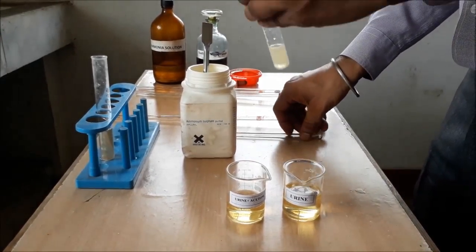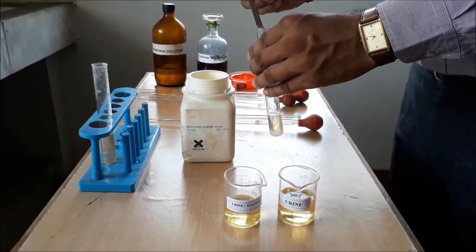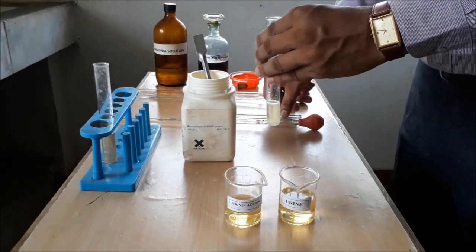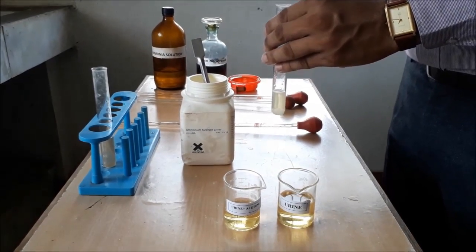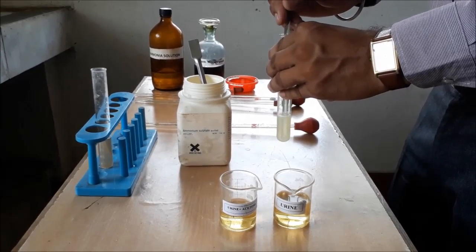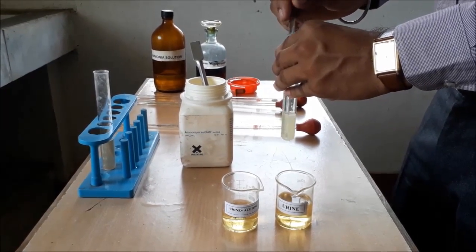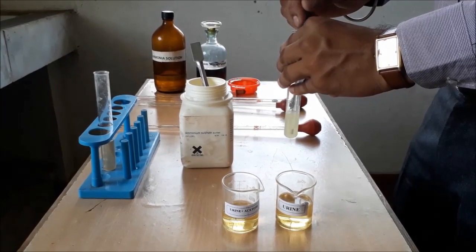When there will be a precipitate or there will be a residue of ammonium sulphate below the test tube, we have to stop dissolving or adding extra amount of ammonium sulphate. After each spatula, we have to dissolve it with the help of glass rod.